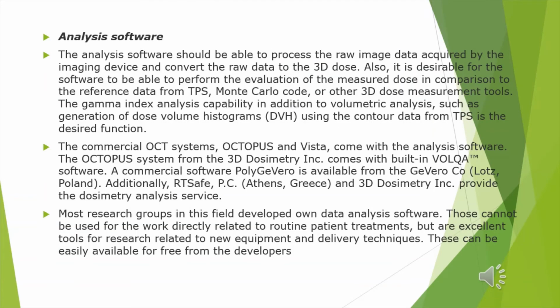The analysis software should be able to process the raw image data acquired by the imaging device and convert the raw data to the three-dimensional dose. Also, it is desirable for the software to be able to perform the evaluation of the measured dose in comparison to the reference data from TPS, Monte Carlo code, or other three-dimensional dose measurement tools.